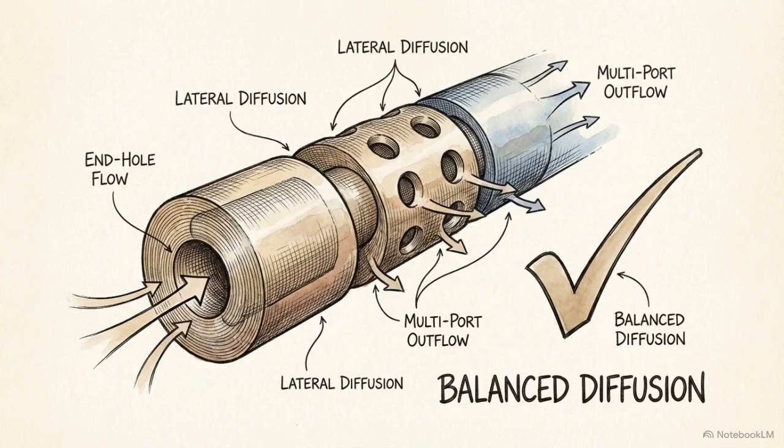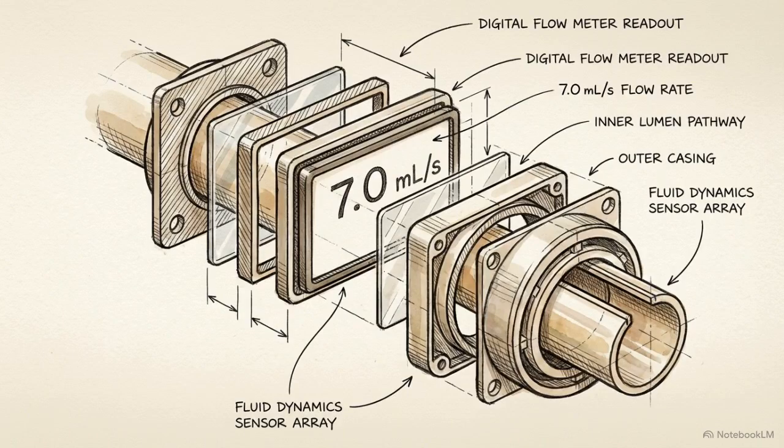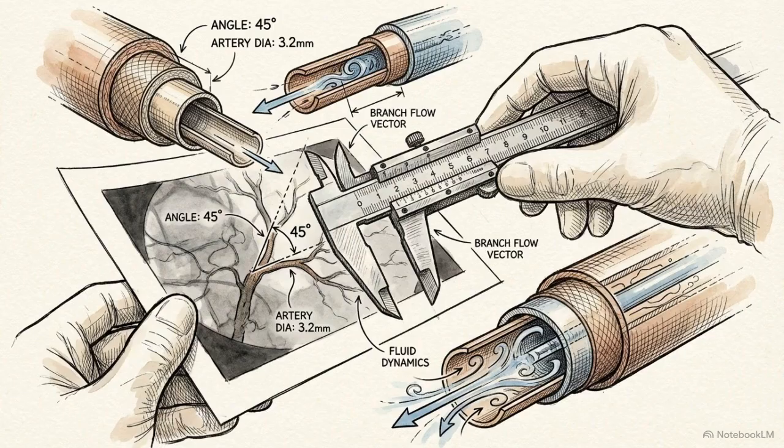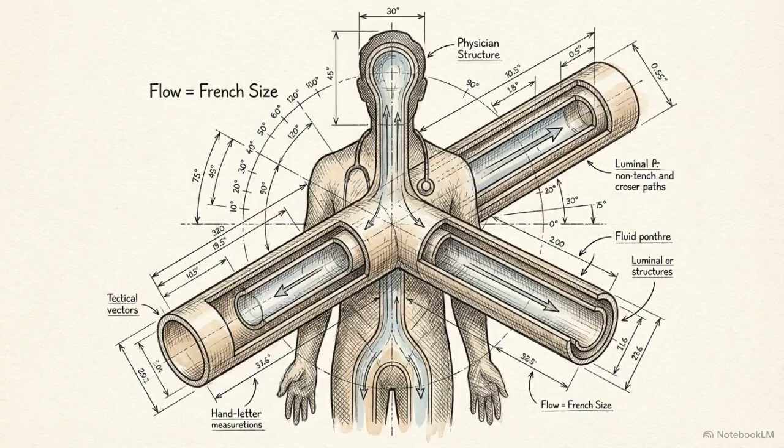To prevent violent backward recoil during the pump run, the operator must select a side plus end hole morphology. With the correct tool in place, the operator can safely push contrast at a rate of 5 to 7 milliliters per second, resulting in complete, high-pressure vessel opacification without displacing the tip. Safe angiography is never the result of trial and error. It is the deliberate, rigorous execution of a mental model that dictates precise rules for physical sizing, vascular geometry, and fluid dynamics.